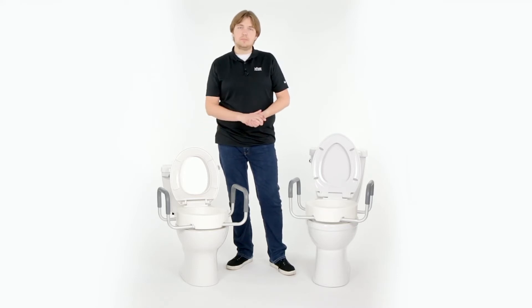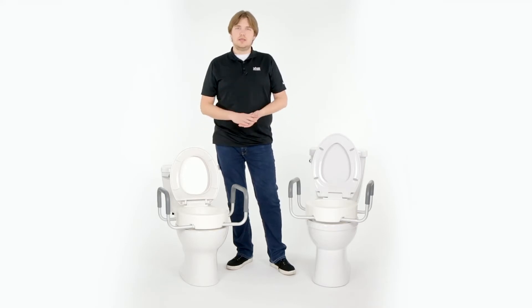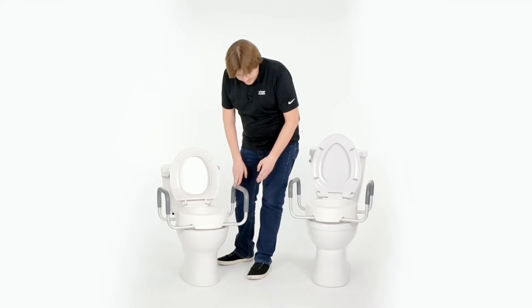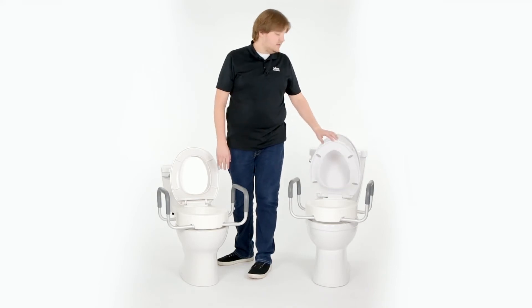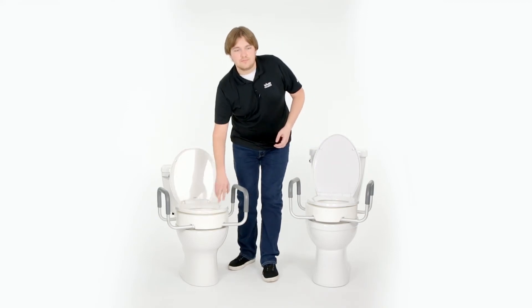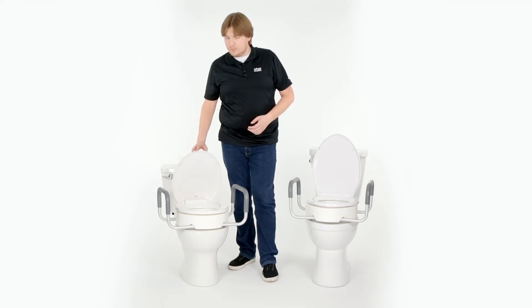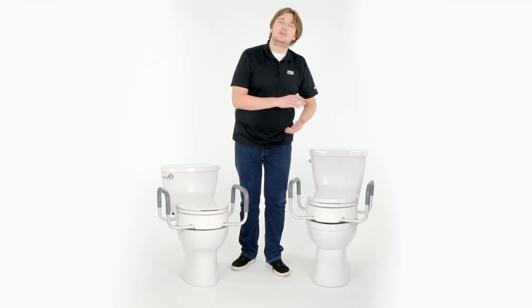The sizes matter when you're selecting the riser that's going to fit — make sure it can secure properly. But regardless of which model ends up fitting best, you're still going to get the same advantages, the same features, the same benefits. The riser is very easy to install, and either model will give you 3.5 inches of added height beneath the toilet seat. That 3.5 inches is perfect for anyone recovering from knee, hip, or back surgery, or just anyone who has limited mobility and could use the extra height in the restroom.